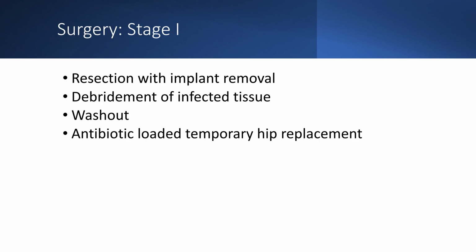So now we move into surgery, and there are several stages. Stage 1 is a very difficult stage because most often there is a well-fixed implant. The implant is infected, and so it has to be removed, but it is bonded to bone. And so part of step 1 is removing the implant. We have special tools for the cup and special tools for the stem, but this does require a significant amount of time to remove a well-fixed implant.